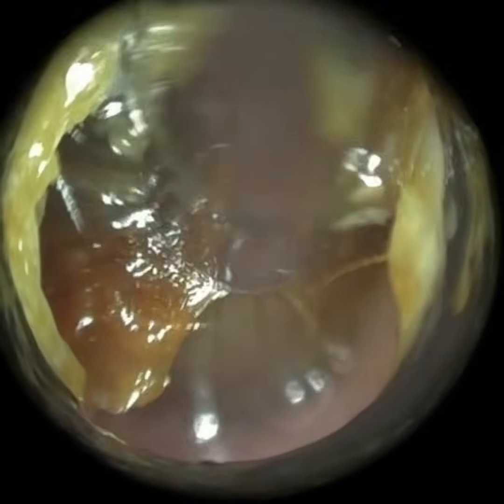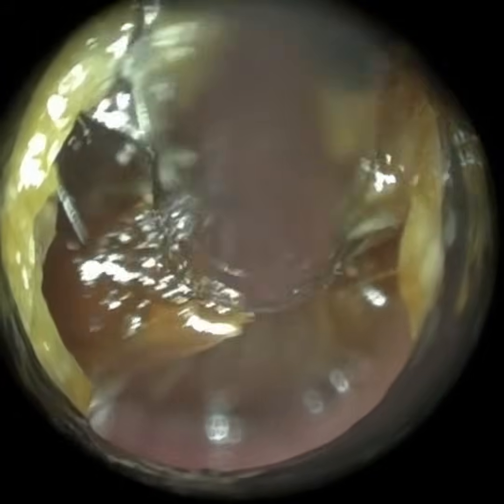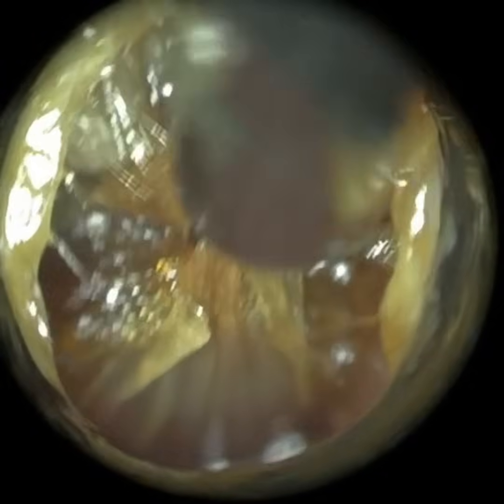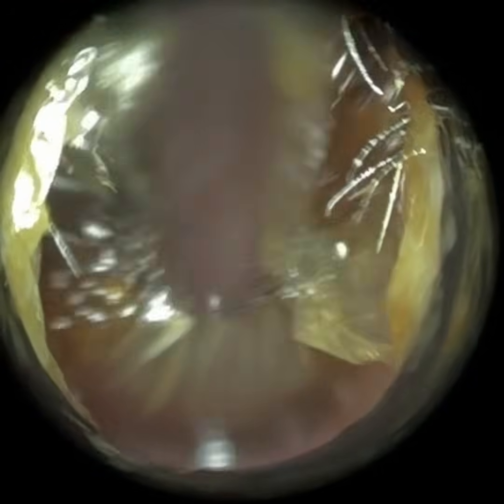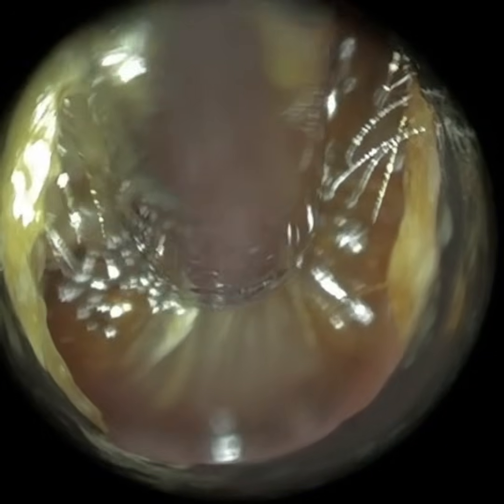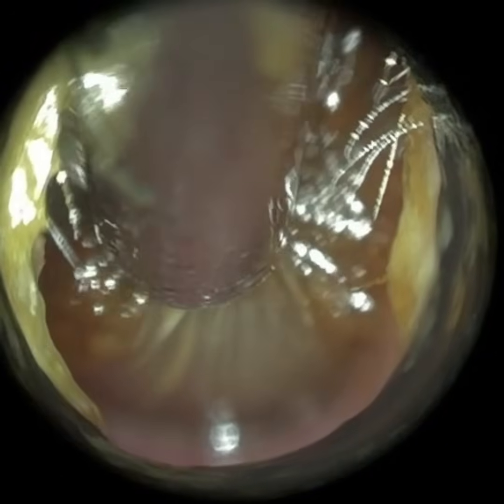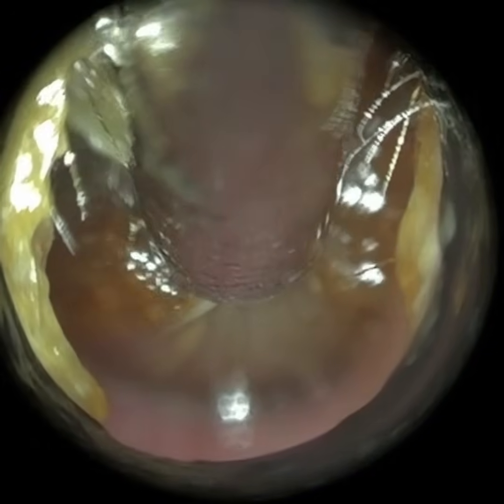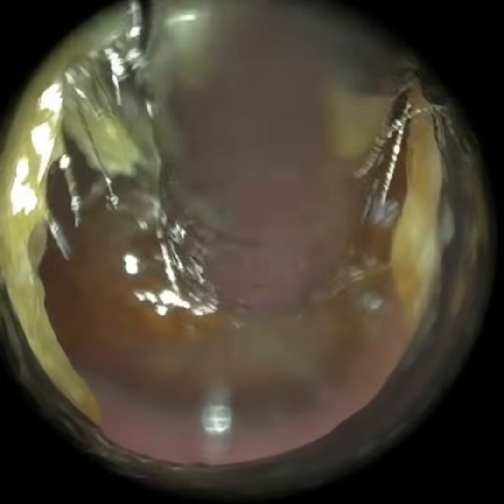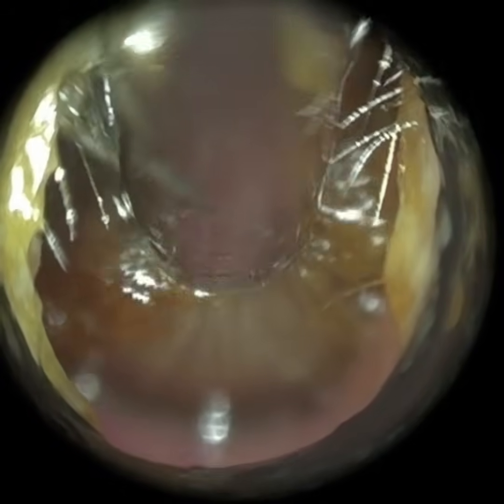And with the few cases that I'm going to upload in the next week, I physically couldn't visualize the recess without using the iClearScope endoscope. And that's where the endoscope is in a league of its own. Whether using an ENT operating microscope or the WAXscope or head loops, you just physically can't visualize that. That's because the magnifying lens is external. It's out of the ear.